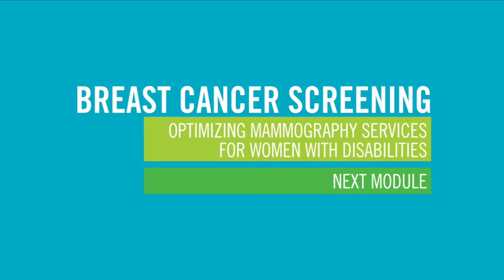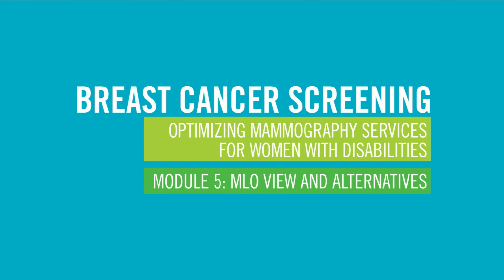In the next module, we will examine the second screening mammography view, the MLO view, and its additional modified alternatives.